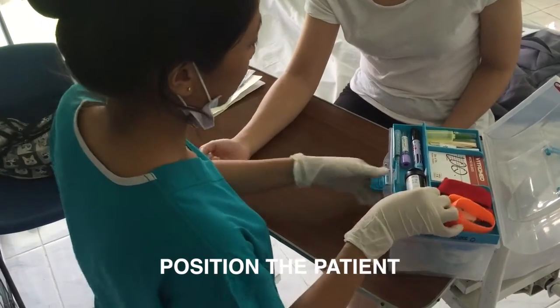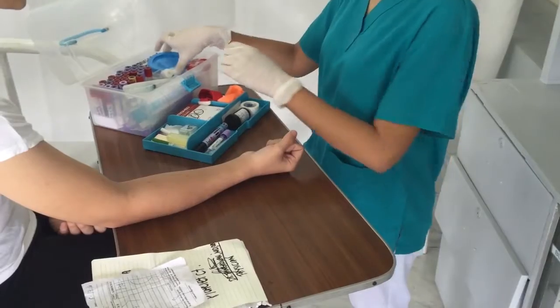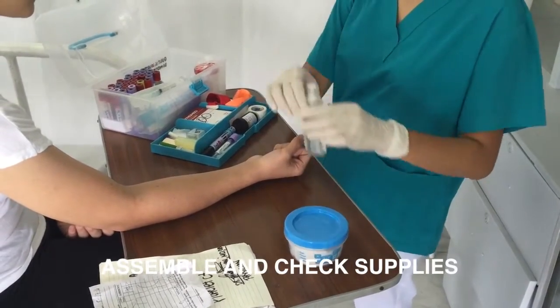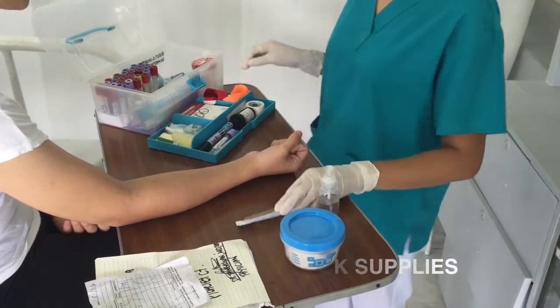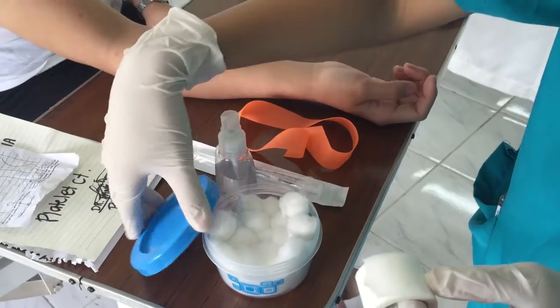Position the patient by moving the arm downward from the shoulders. Assemble and check supplies — check the expiration dates, cracks in tubes, needles in tubes, etc.